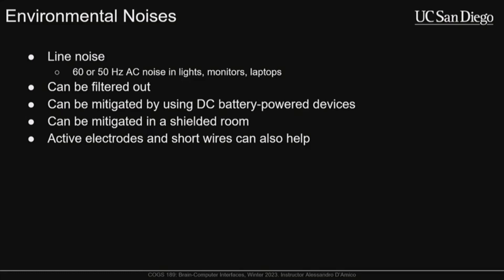Actually, there's a bit of a debate, or quite a debate, depending on who you talk to, about whether or not active electrodes are even worth anything. There are a lot of experimenters that just are like, nope, all you need is a clean recording condition, and passive electrodes and short wires are all you need. But if you're trying to record in noisier environments like a workplace or a hospital or something that just has electrical noise, like a forest has trees, then you're going to need to think a little more carefully about shielding and active electrodes.